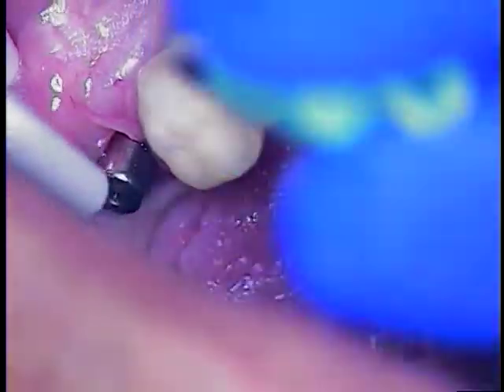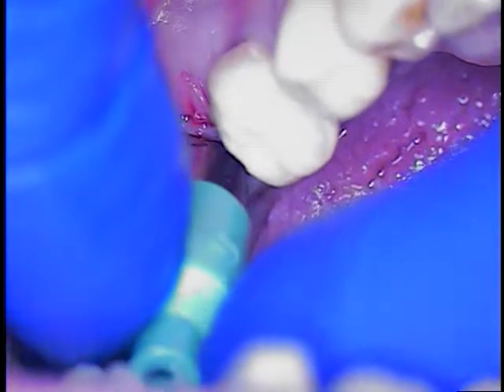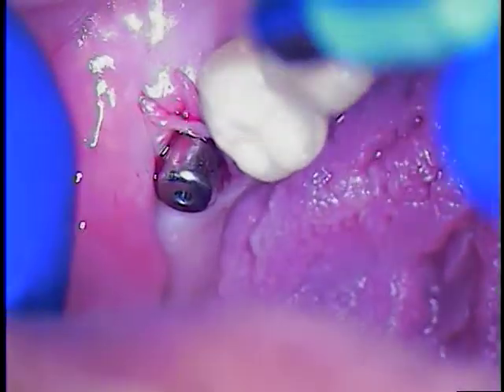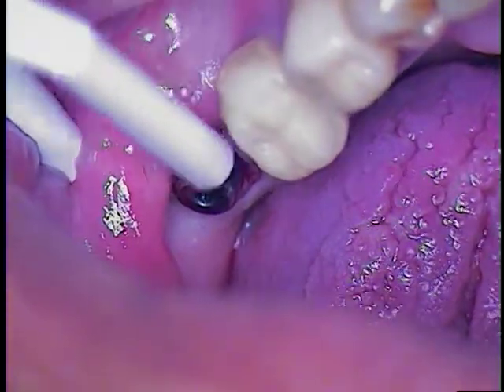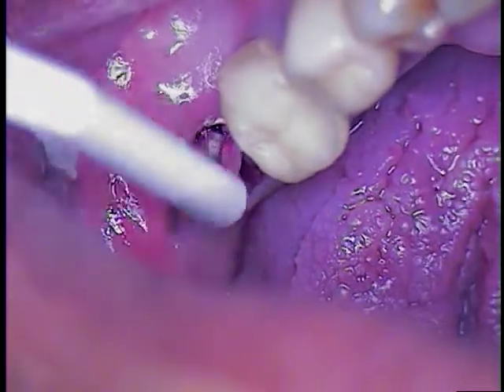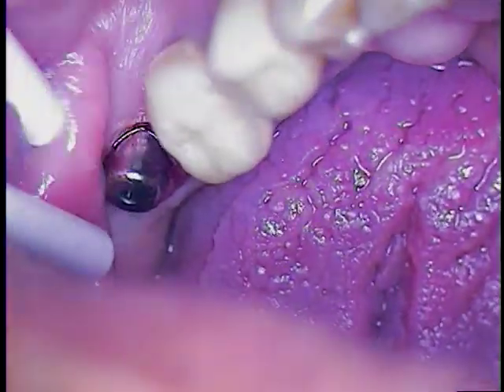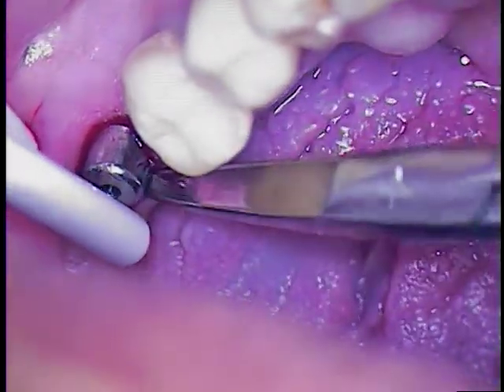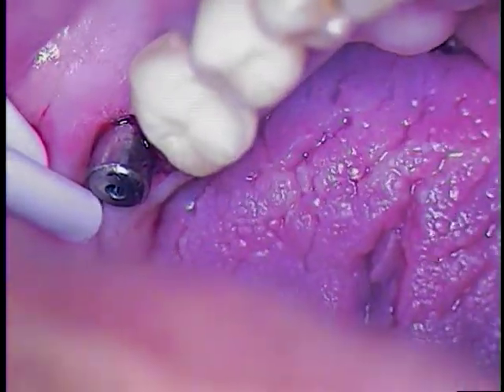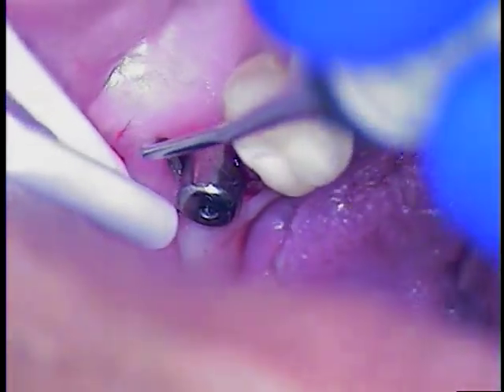I'm going to take my punch again and try to retrace. It gets to be a little harder now to retrace, so I gave it one good push. We'll take a hemostat and use some scissors. If you have a laser, this is a perfect opportunity — I don't. I'll just use my scaler and come up onto the abutment.